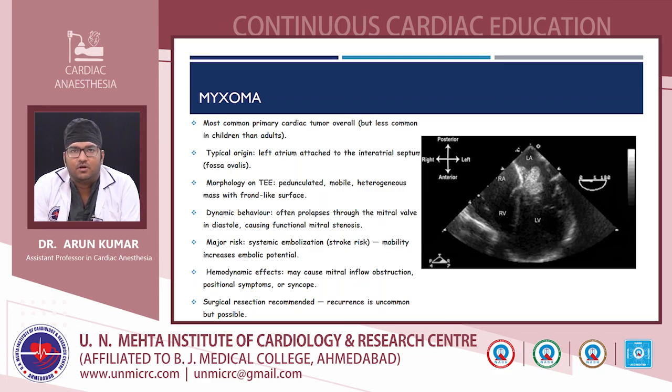This image shows a mid-esophageal 4-chamber view, showing a moderate size lobulated left atrial myxoma attached to the left atrial aspect of the interatrial septum, just posterior to the aortic root.